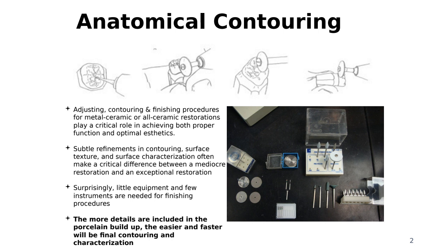We have five, right? So you learned the general shape of the tooth, but now you take that general shape and you customize it for the patient, and you customize it for two reasons. First and primary reason, it's function.